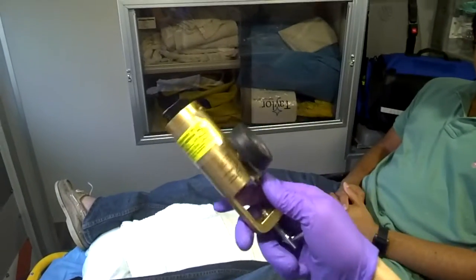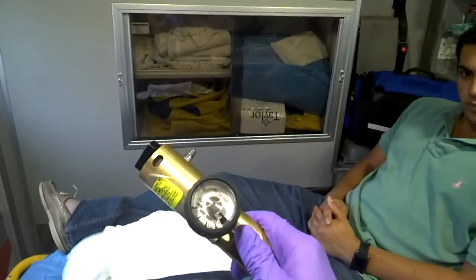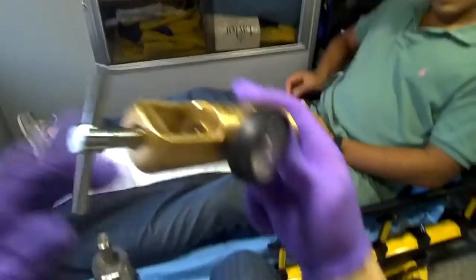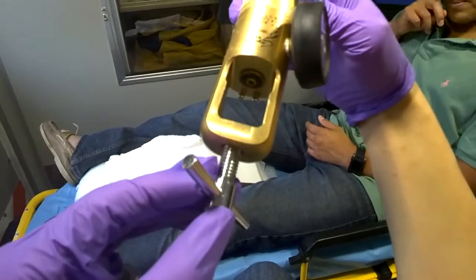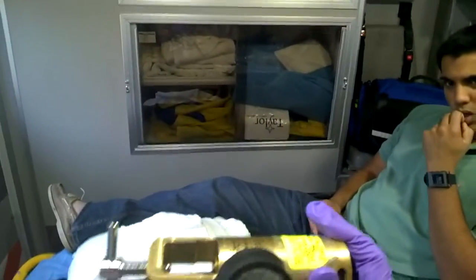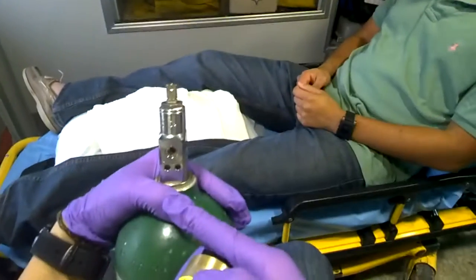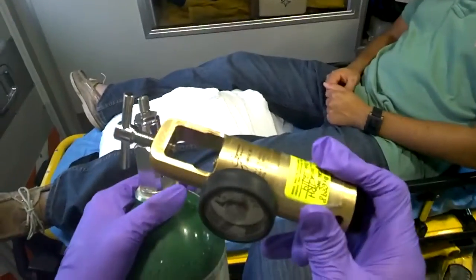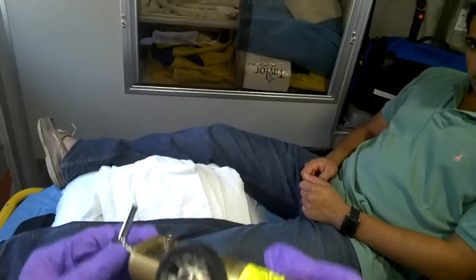And the next thing you want to do is put on a regulator, and this regulates how much oxygen comes out of the oxygen tank. So you can see there are two prongs and a middle valve where the oxygen goes in, and you just want to match it up with the oxygen tank. So there's two prongs, and you want to bring them down.